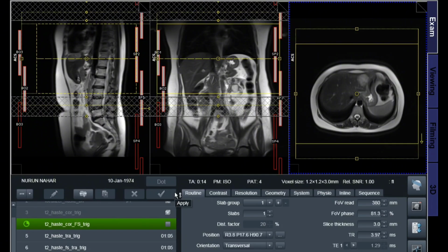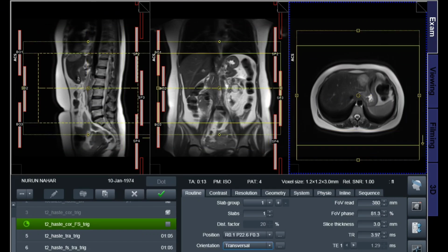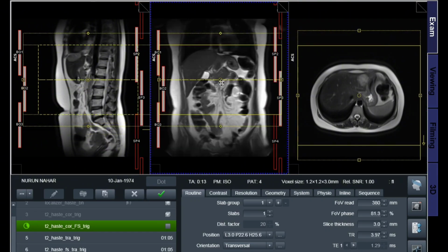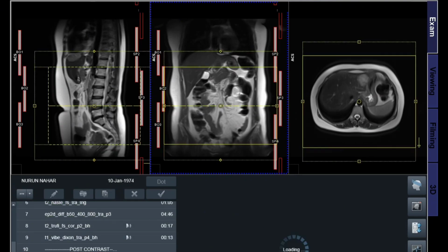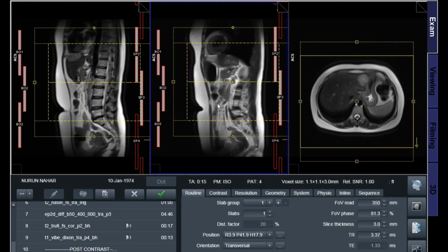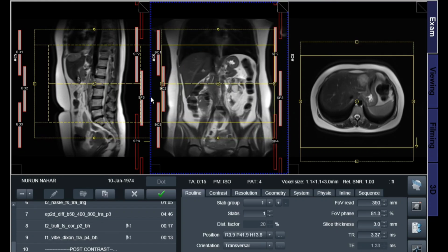Contrast-enhanced MRI HBS. Contrast-enhanced MRI uses gadolinium-based contrast agents. Dynamic phases include arterial phase, portal venous phase, delayed phase. In some cases, hepatobiliary-specific contrast agents are used, such as gadoxetic acid. These agents are taken up by hepatocytes and excreted into bile, improving lesion characterization.